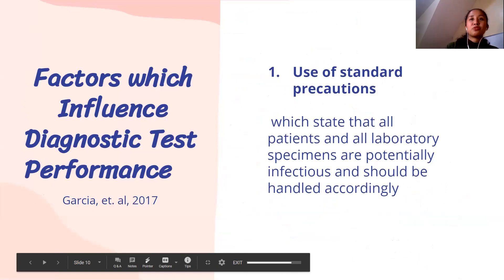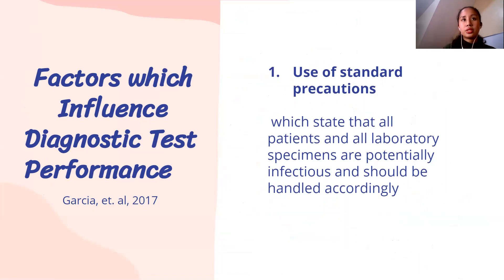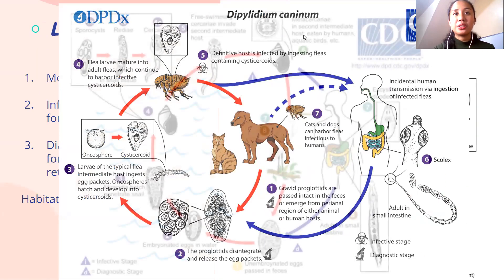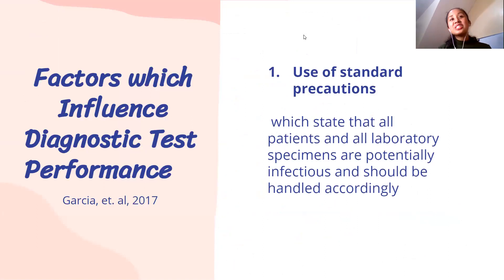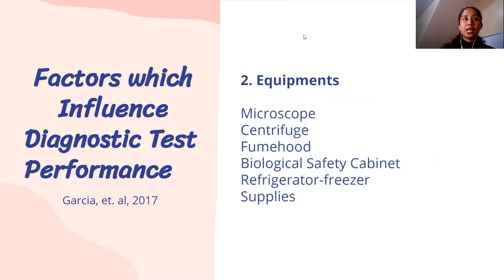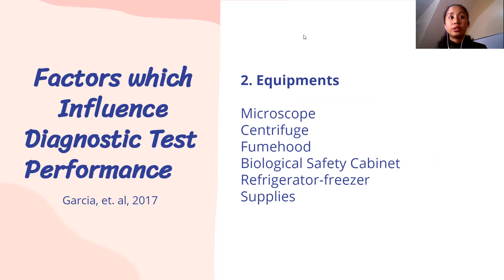What are the factors that influence diagnostic performance? First is the use of standard precautions — treat all specimens, whether blood or any other, as potentially infectious and handle accordingly. Second, good quality equipment matters: microscope, centrifuge, fume hood. A biological safety cabinet is not required in the parasitology laboratory but can be used if budget allows — specifically class 2.